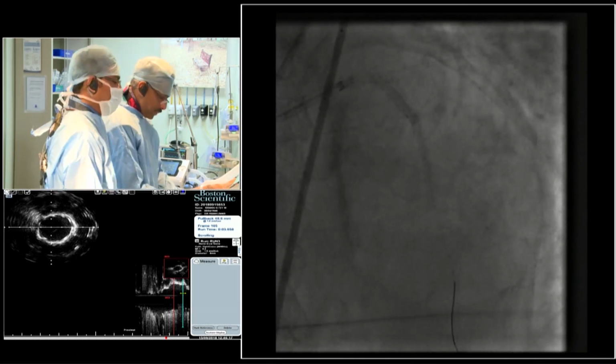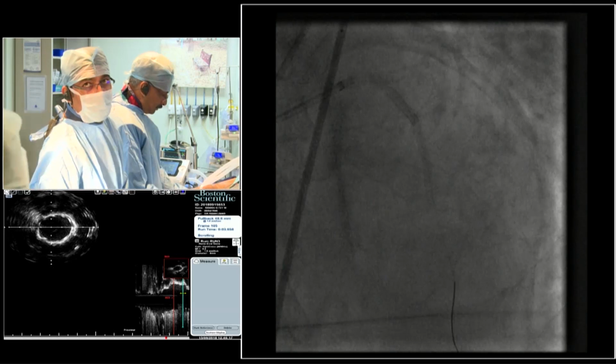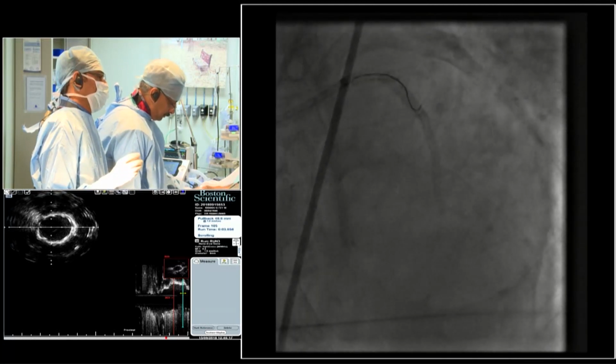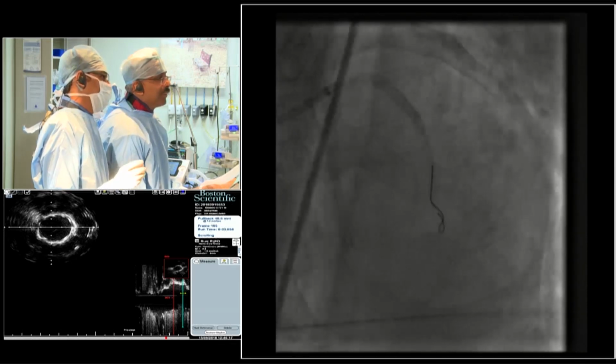Okay, 3.0 balloon system. Get the 3.0 balloon, please. Vijay, we have 3 minutes more. Yeah, sir, we're going to quickly do the 3.0 and 4.0 and finish. Oops, sorry. This is what happens when you start hurrying the case. Oops.